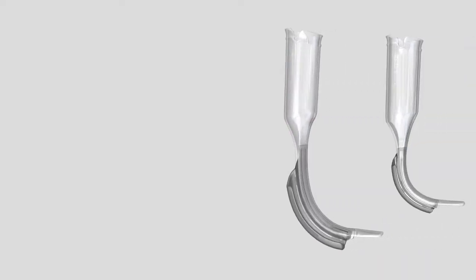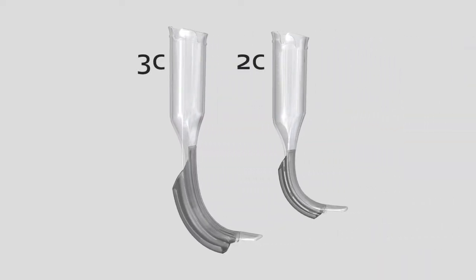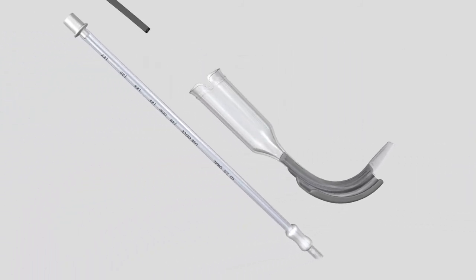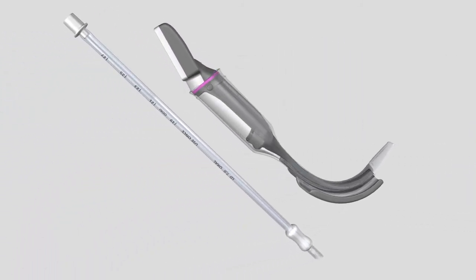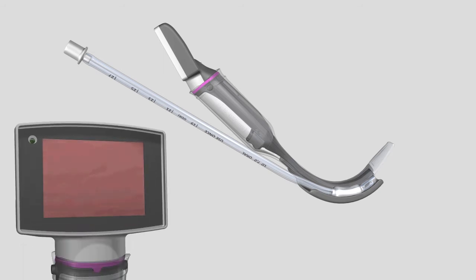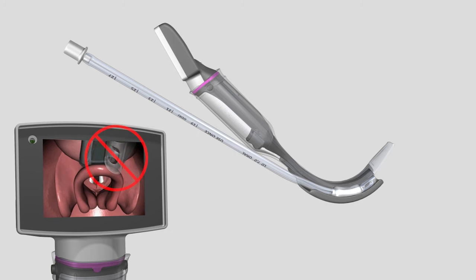The channeled blades are designed to be used with standard endotracheal tubes without the assistance of a stylet. To begin intubation with a channeled blade, lubricate the ET tube, the guiding channel of the blade, and the tip of the blade with a water-soluble lubricant, taking care to avoid covering the distal window of the blade. The ET tube may be preloaded into the guiding channel with its distal tip aligned with the end of the channel. The tip of the tube should not be evident on screen when loaded properly.